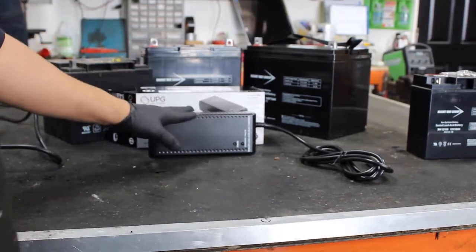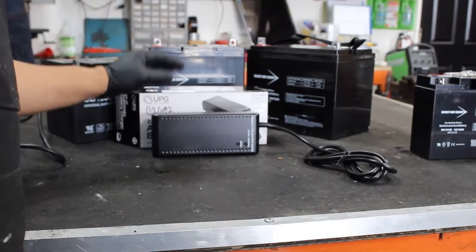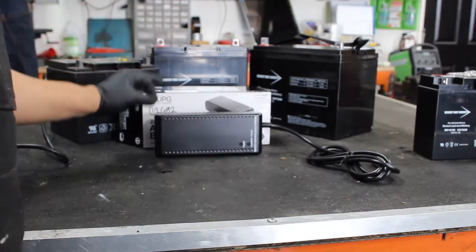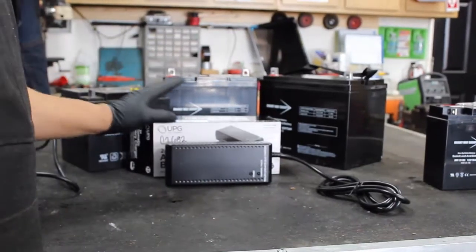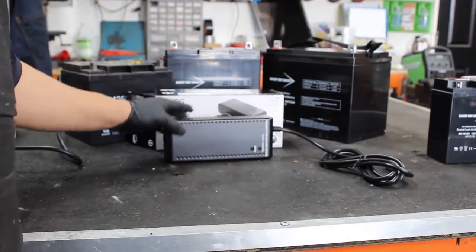If you tried using a car charger for these batteries, they will swell up. It's too fast of a charge and they can explode — they can catch on fire. So just so you understand, using the proper charger is very, very important.